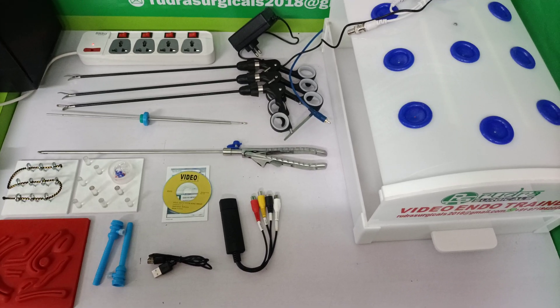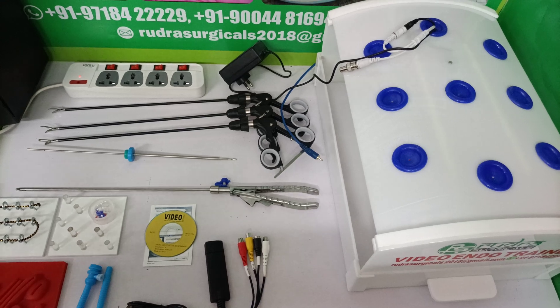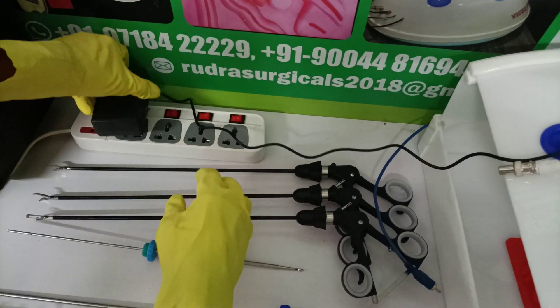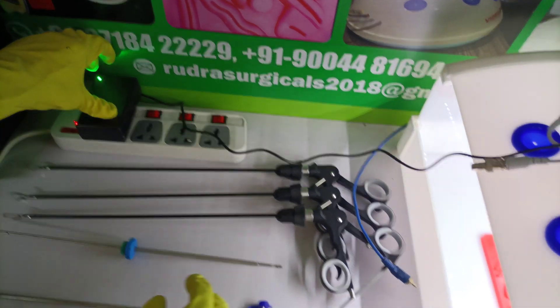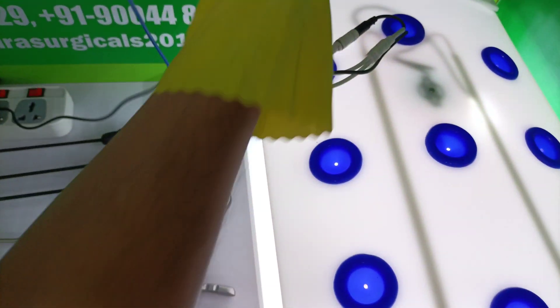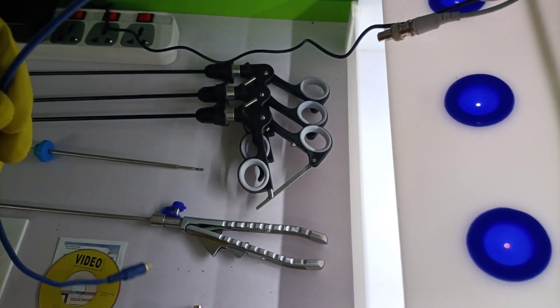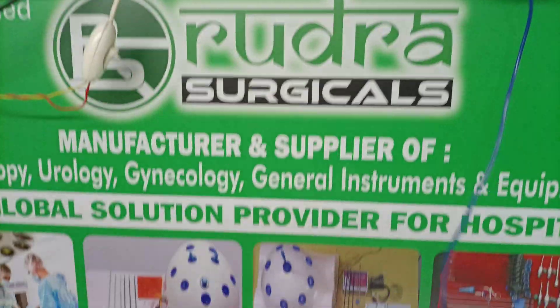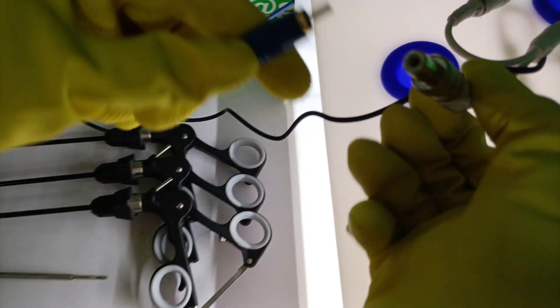Now I am going to show you how to connect this into the trainer TV. First we have to attach this adapter. Second, this is a video cable — one end is connected to the TV in the yellow port, and the second end will be connecting here.